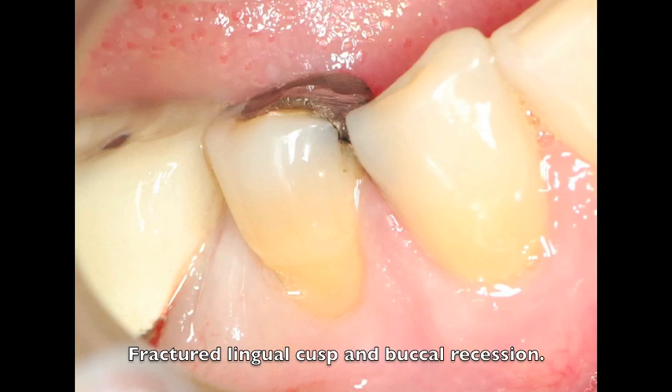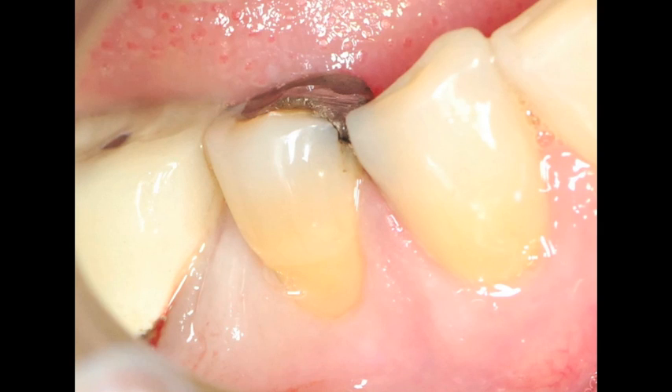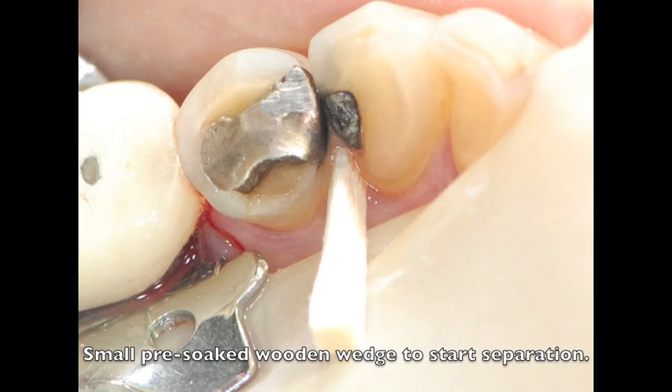My final case is an example of a difficult Class II composite where the patient fractured off the lingual cusp of a lower first bicuspid in contact with a cuspid, where the contact area is so narrow that it's very difficult to get separation with a separating ring. As with all my cases, I pre-wedged my teeth to start the separating process.